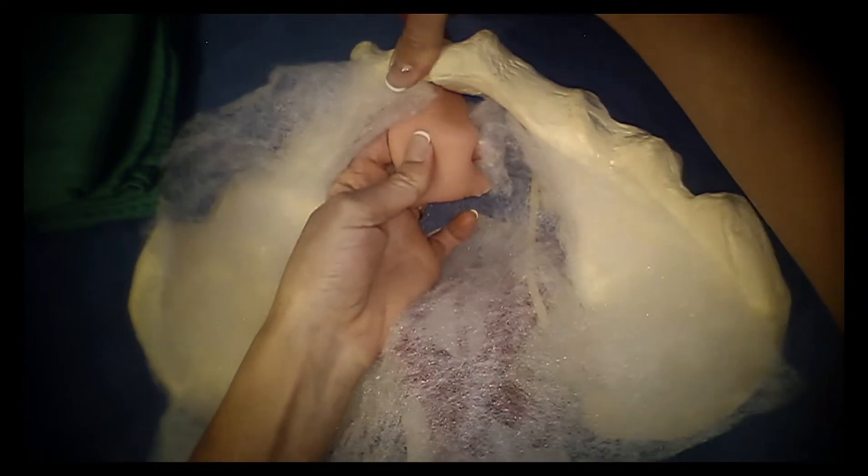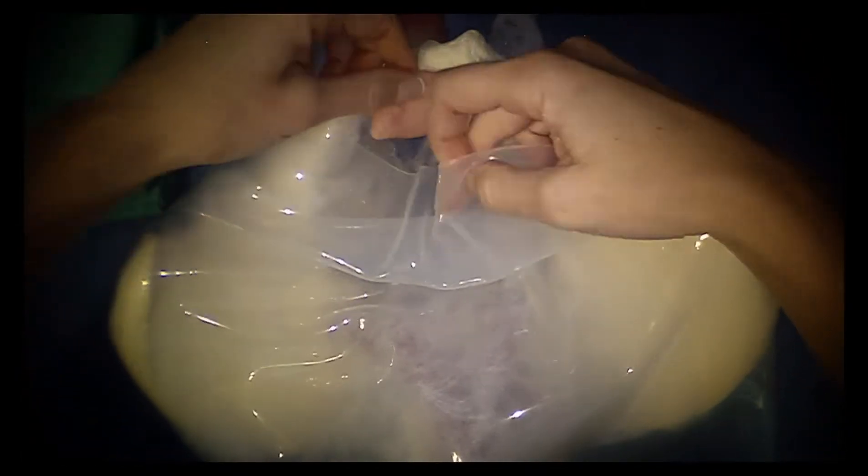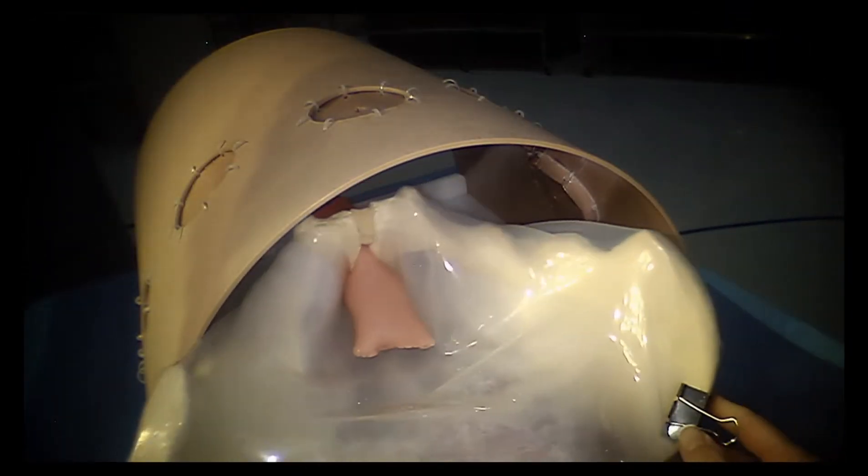Quilt batting was placed over the vasculature and ureter to simulate the areolar tissue under the peritoneum. The vaginal cuff was prepared by previously closing it with a running barbed suture, and it was secured at the pubic arch. Next, the peritoneal layer was placed and secured with binder clips attached to the periphery of the bony pelvis.